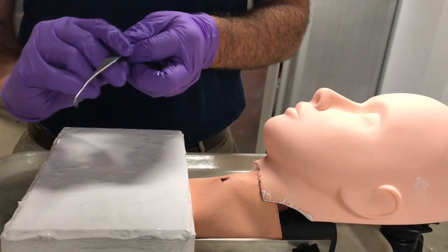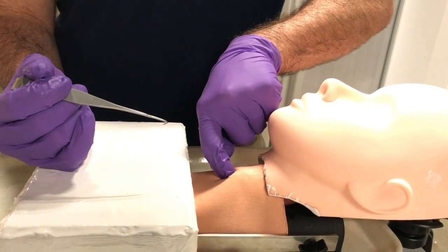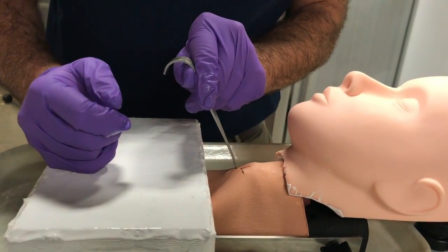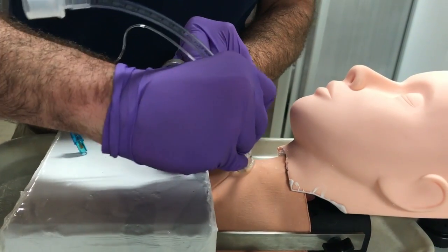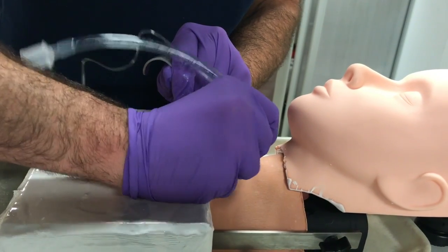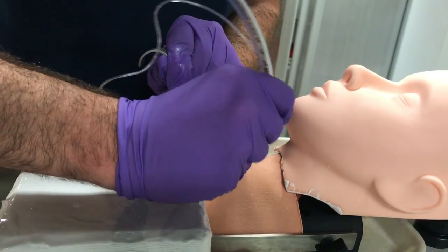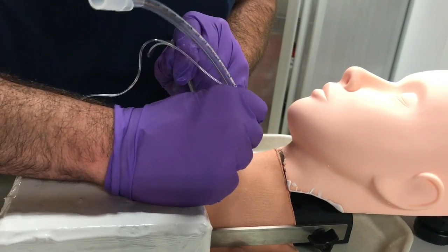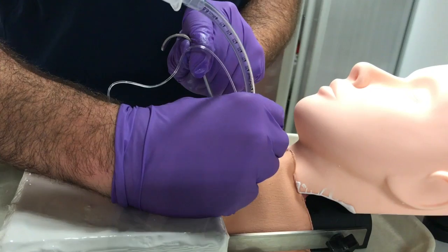For the rapid four-step technique, instead of using the trach hook to elevate the thyroid cartilage, you use the trach hook to elevate the cricoid cartilage inferiorly. You do not use the dilator, and you insert your endotracheal tube using just the tracheal hook, inserting it to just beyond the balloon.